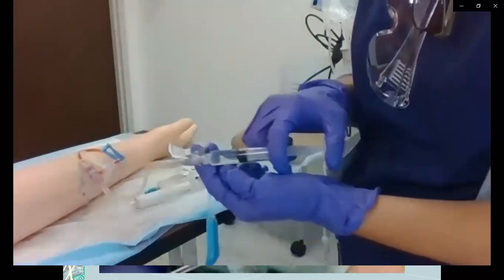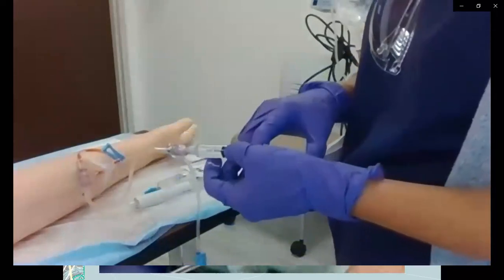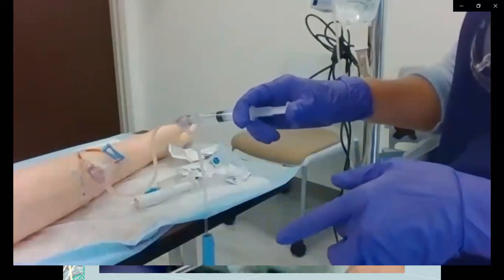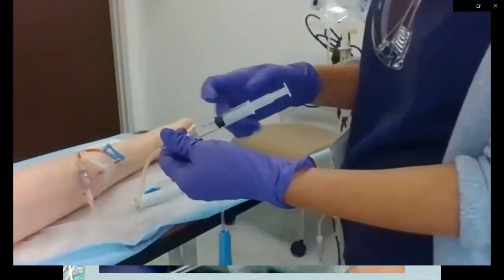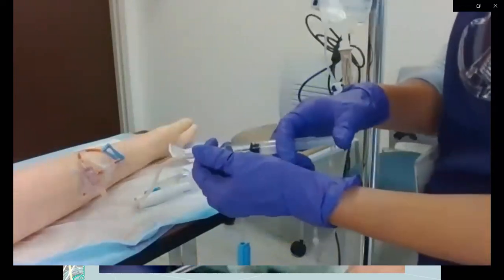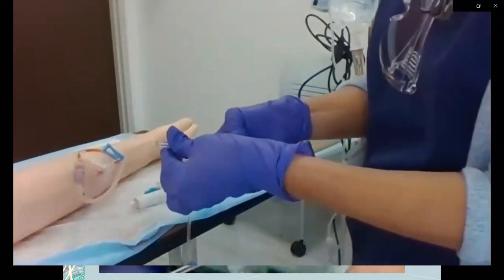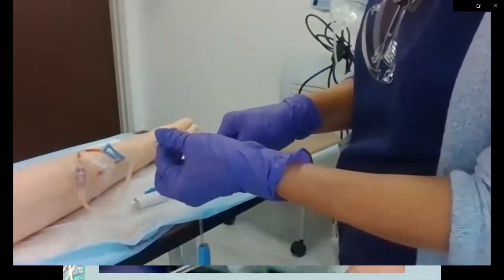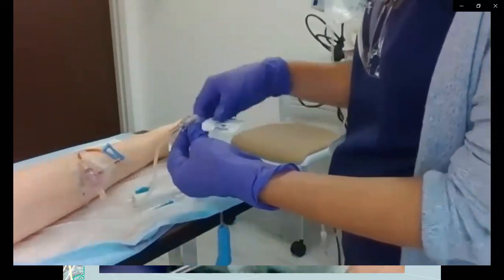I typically, what I'll do, like this is 3 mLs. If I'm administering that over 3 minutes, then I'll watch the clock and make sure I'm just administering 1 ml a minute. So I kind of split up my volume and think about over how many minutes I want to give it. So do keep an eye on the clock because I promise you when you are just slowly giving a medication over 5 minutes, that 5 minutes is a lot longer than what you think it is. So take your time and be accurate because you will hurt your patient if you are not.